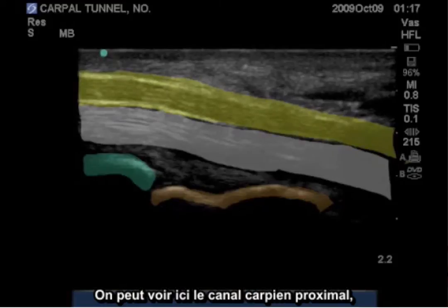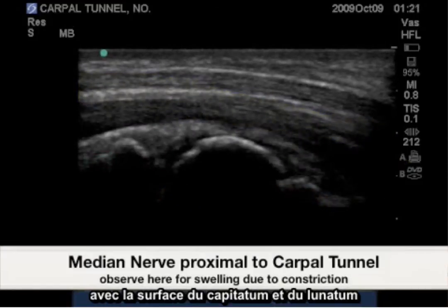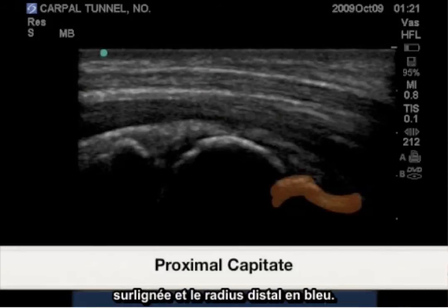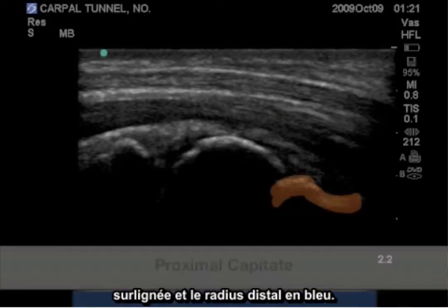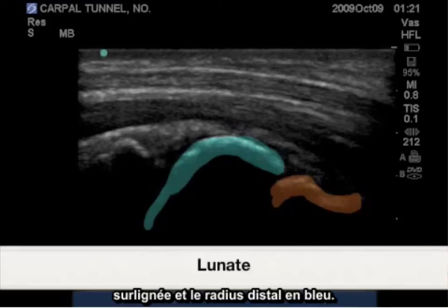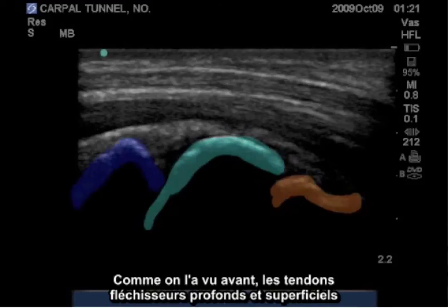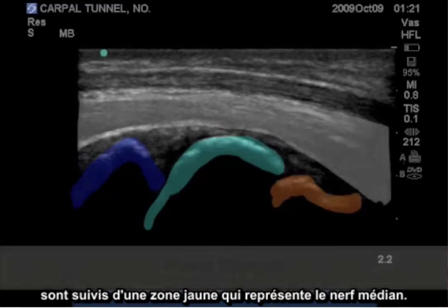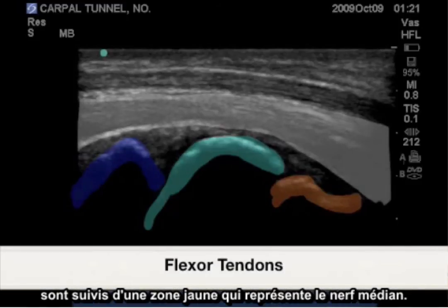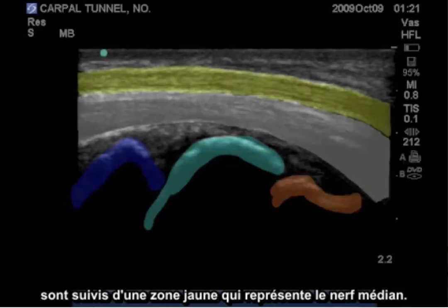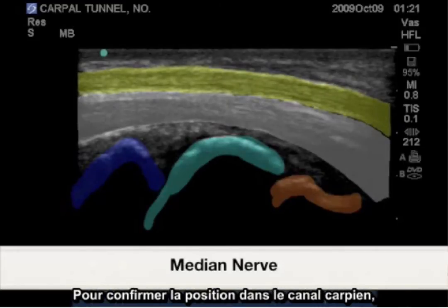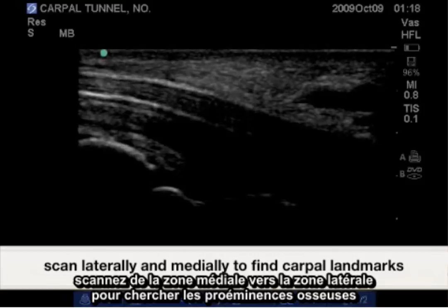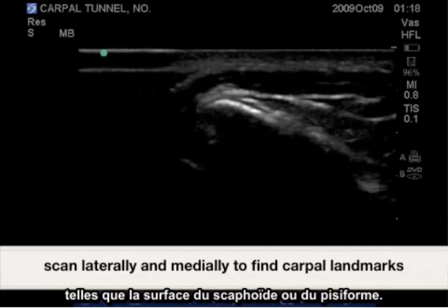Seen here is the proximal carpal tunnel. Highlighted is the proximal capitate surface, lunate surface, and distal radius in blue. As seen before, we have the deep and superficial flexor tendons, followed by the yellow representing the median nerve. To confirm position within the true carpal tunnel, scan medial to lateral for the bony prominence such as the scaphoid surface or pisiform.